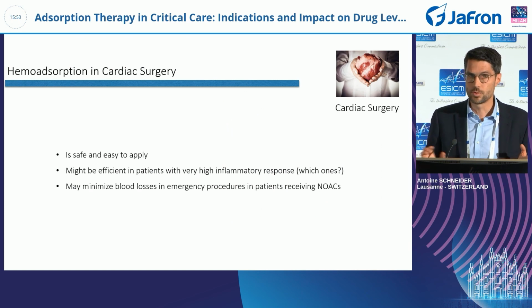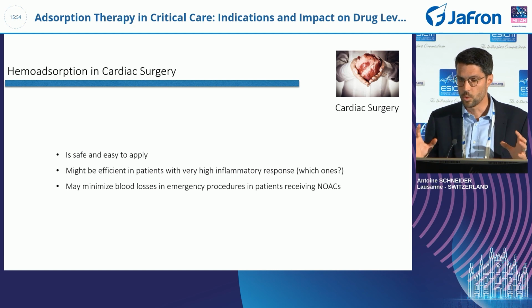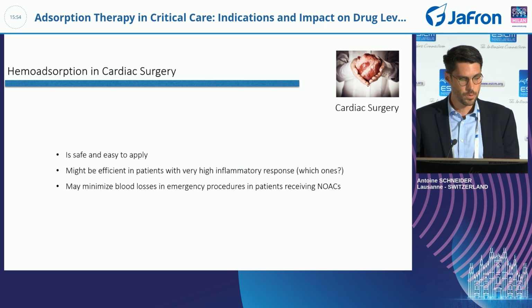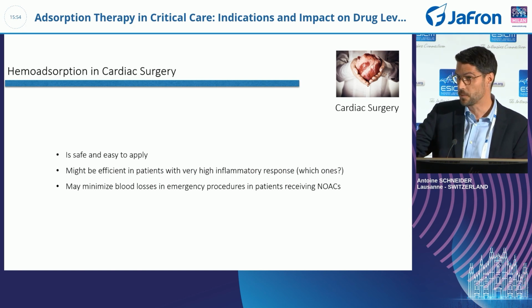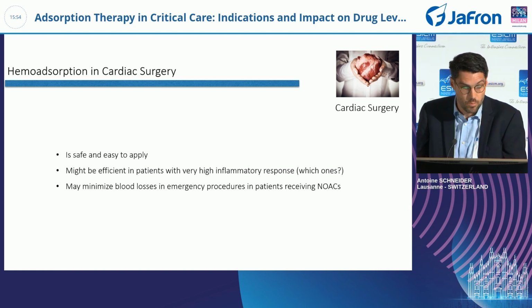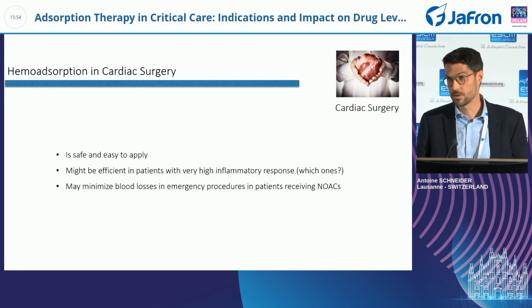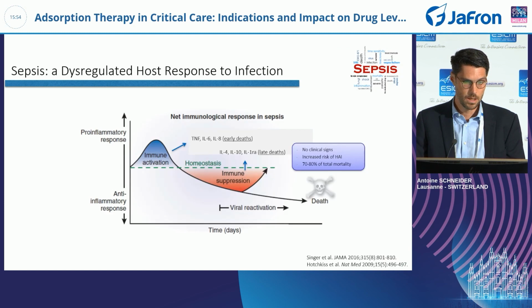So basically, to wrap this up with cardiac surgery, and then the next speaker will go into more detail with that, we can say at this stage it's safe, it's easy to apply, it might be efficient in patients that have a very high inflammatory response. But how to identify them pre-operatively, or at least peri-operatively, because you have to decide to put it while it happens. And it might minimize blood losses and certainly drainage in emergency procedure in those patients that are treated by these medications cleared by the system.